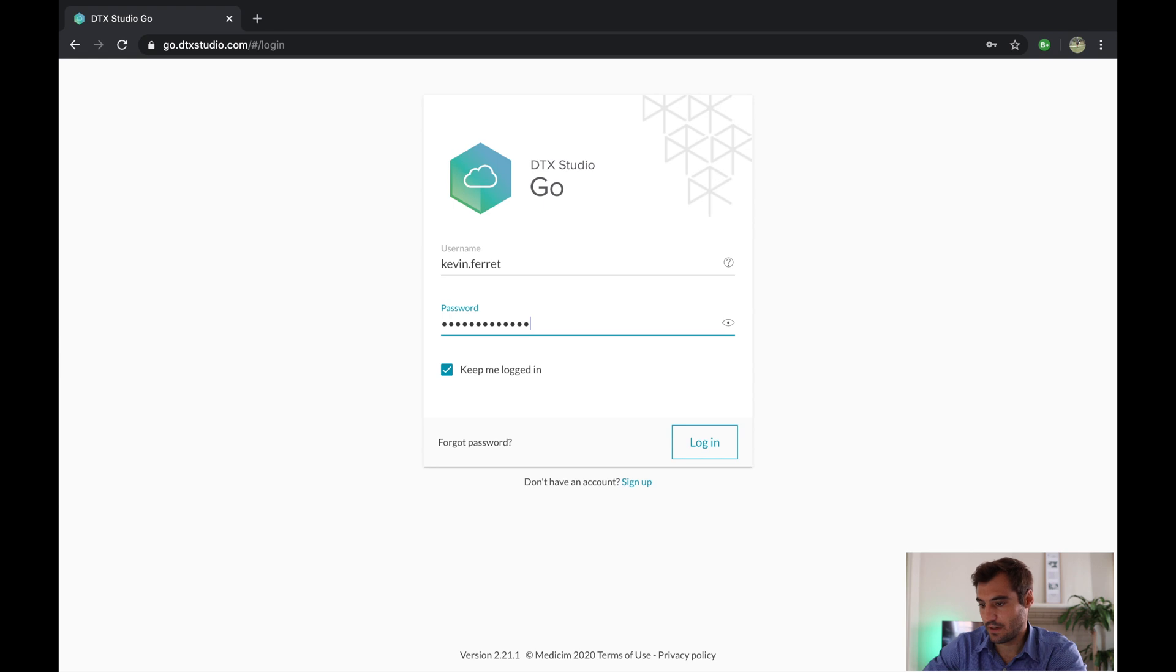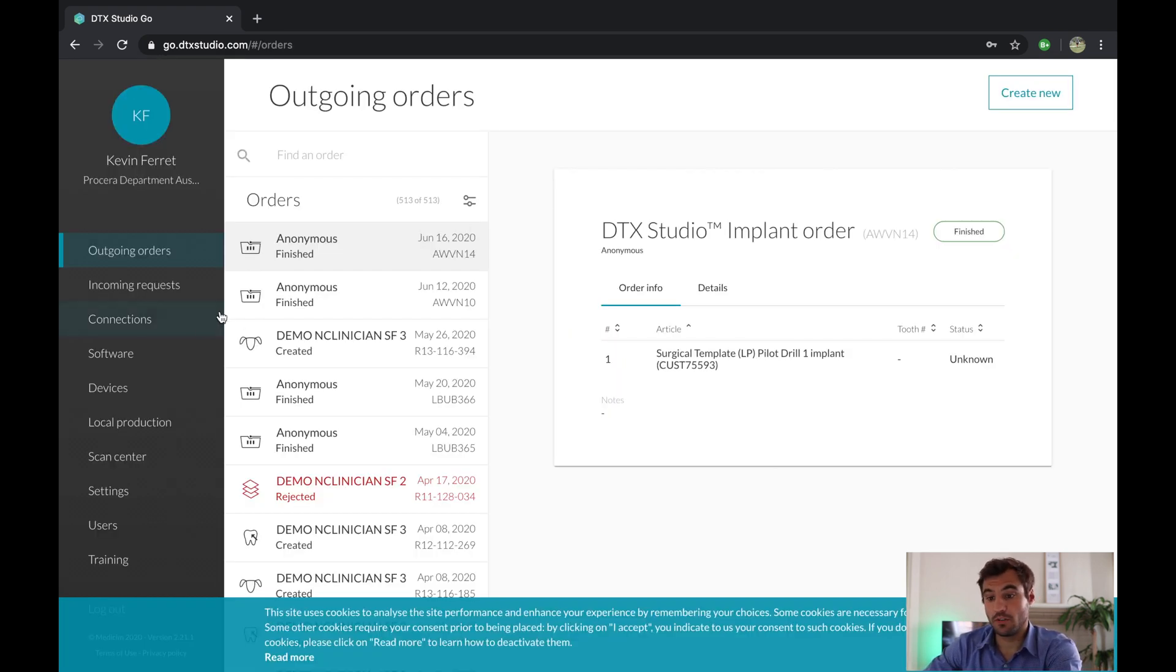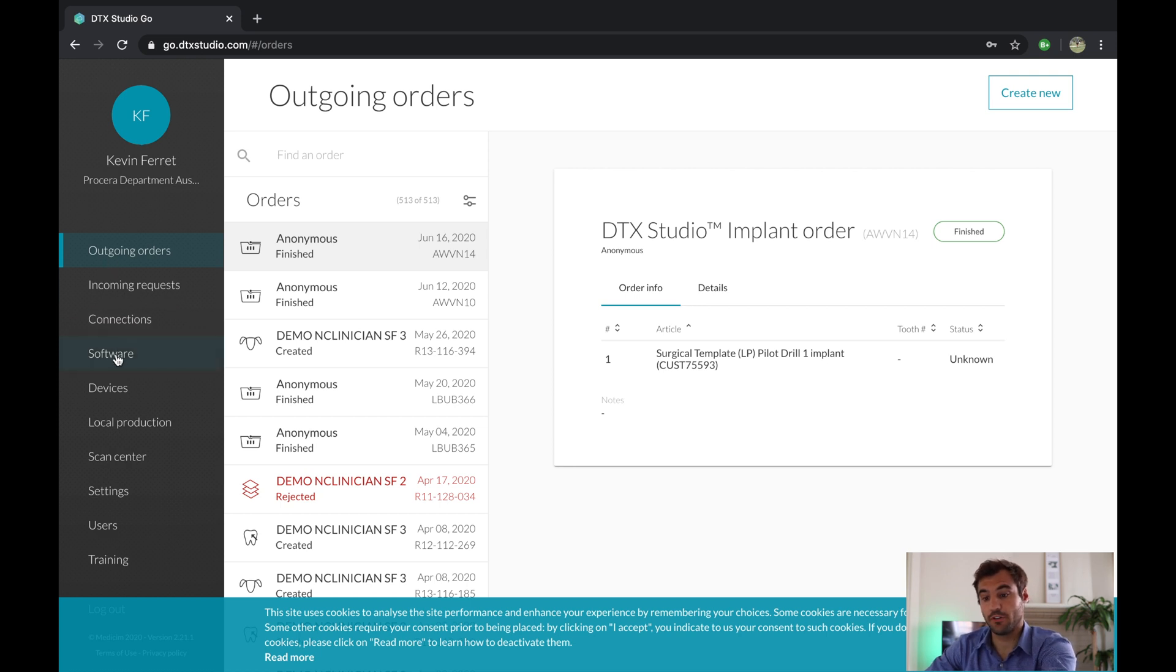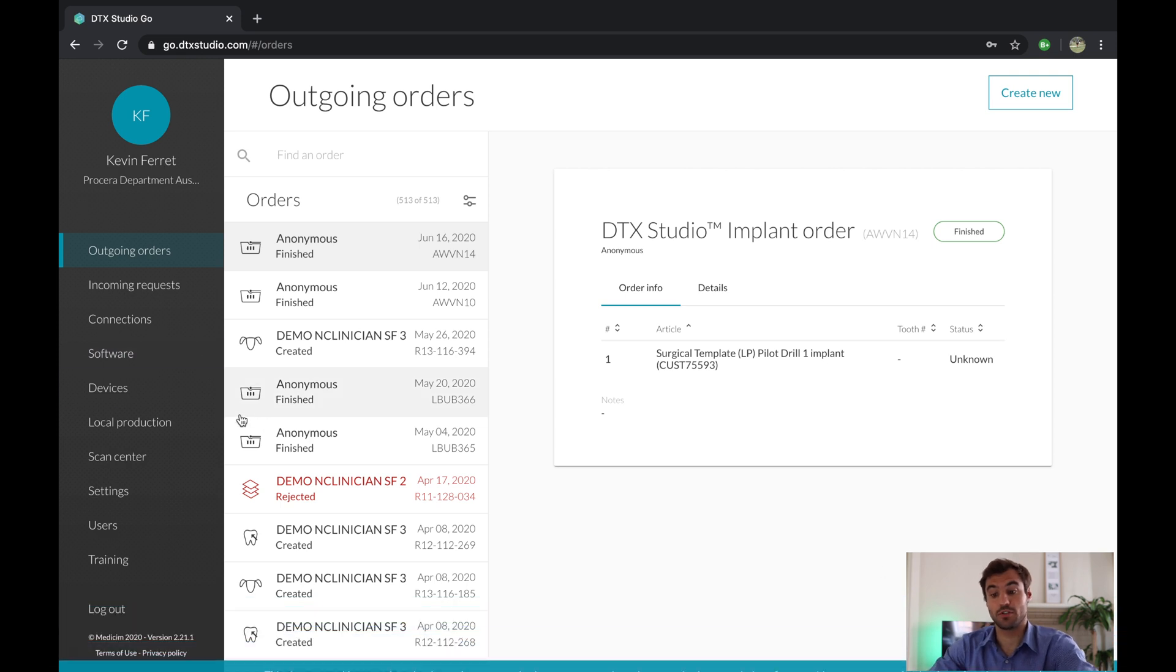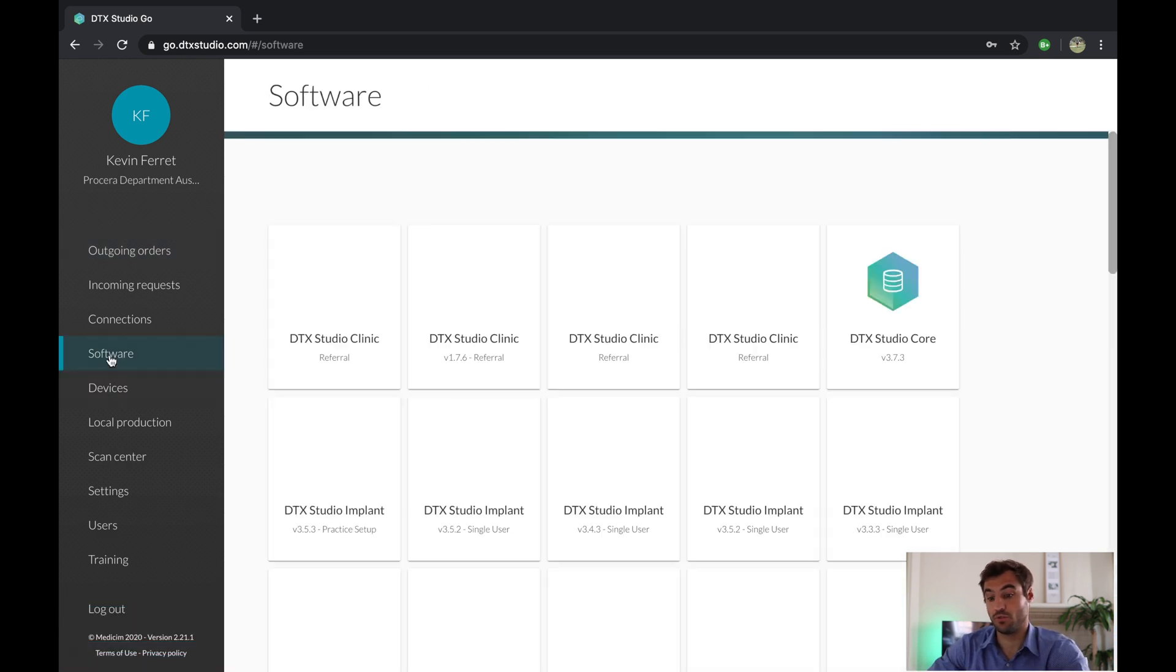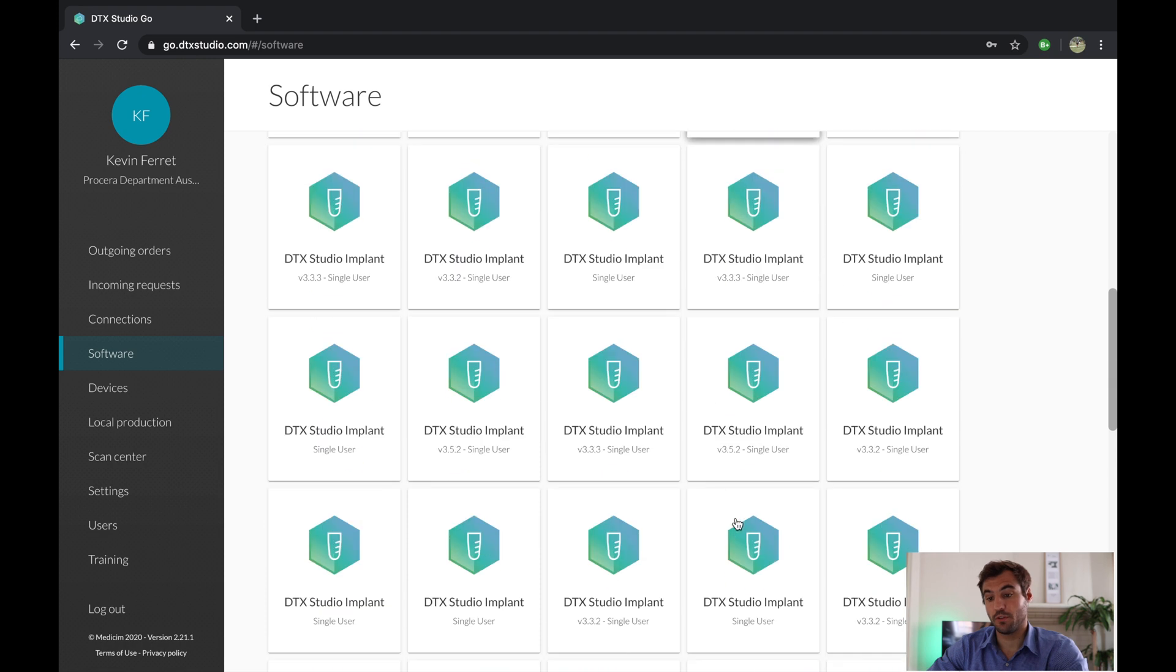Alright, once on that page you're going to see on the left inside of the screen: outgoing orders, incoming requests, connections, software, devices, local production, and all of the other tools here.